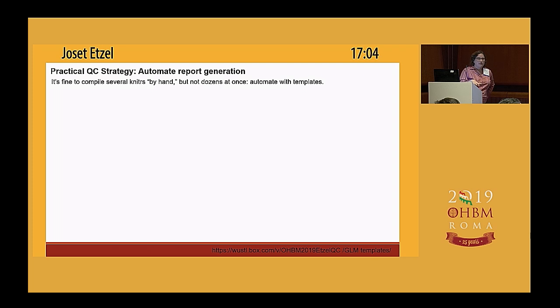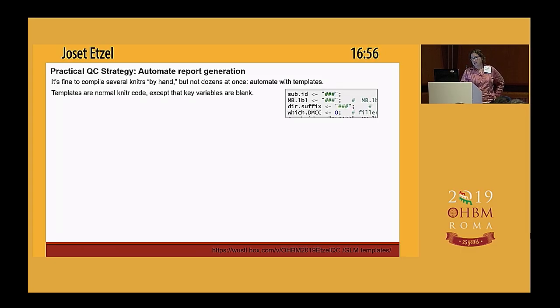And that's good if you're doing stuff interactively, but sometimes you just want to have a set of standard files. You don't want to be doing everything one at a time. So for those movement files I was showing you earlier and the behavioral summary files, those are something that we want run on every single subject. I'm not going to be interactively making it up again every time.